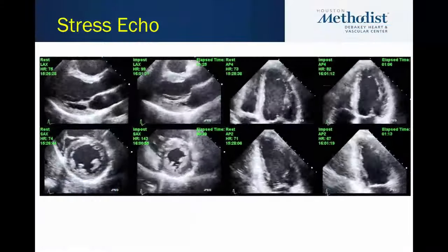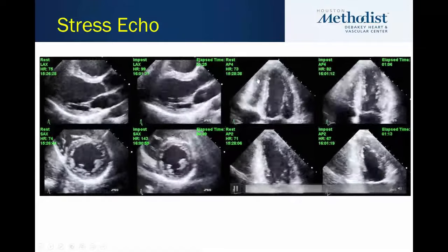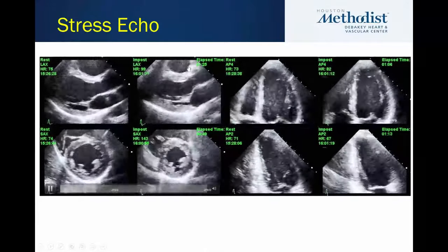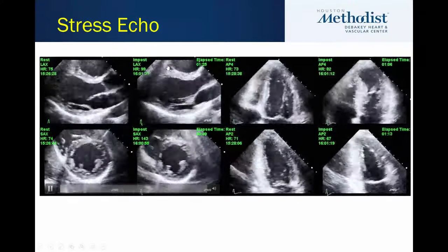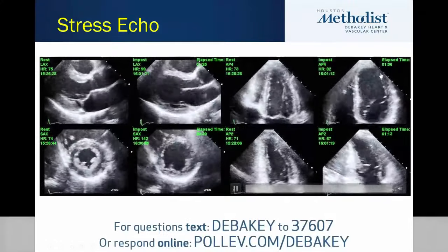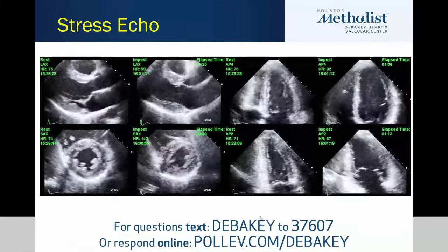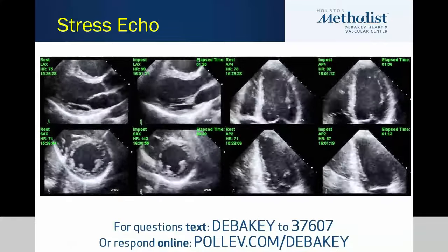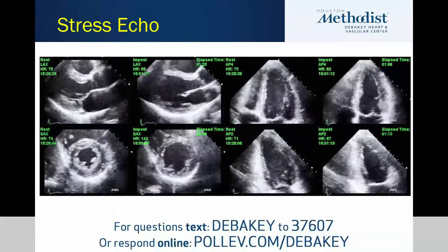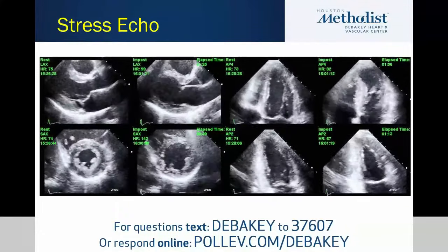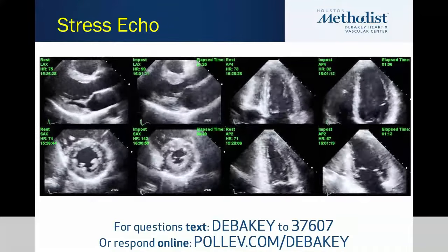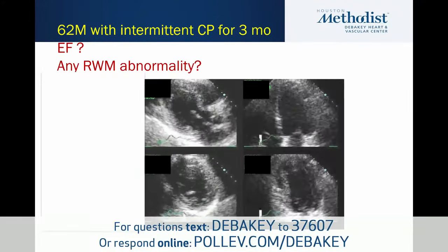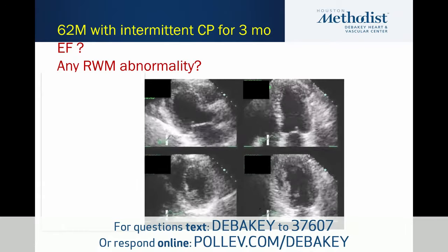This is a normal treadmill exercise stress echo. The resting views are on the left and the immediately post-exercise views on the right. In all post views you can see more vigorous contraction, a smaller end-systolic cavity, and improvement in ejection fraction — typically we define a 5% or higher improvement in EF as normal.